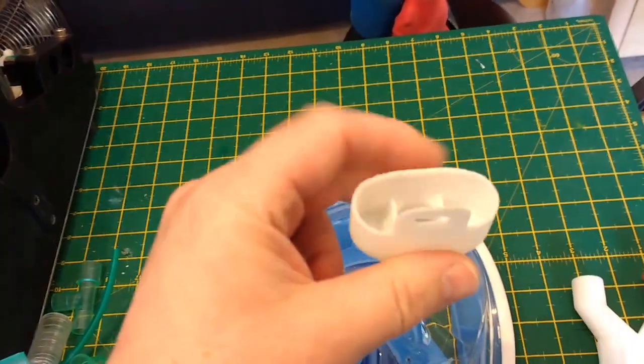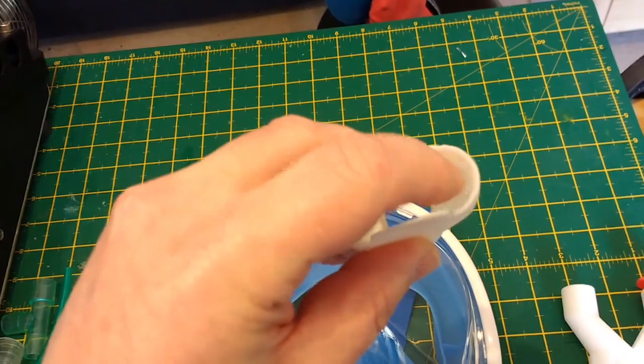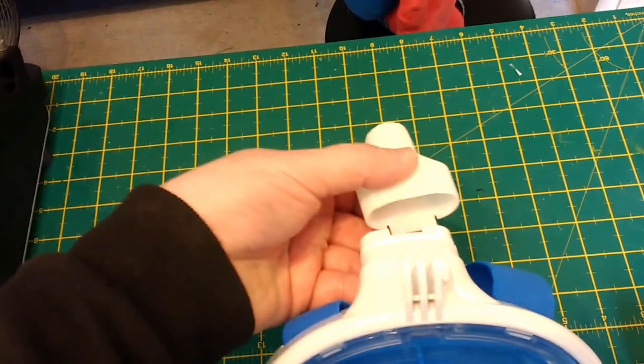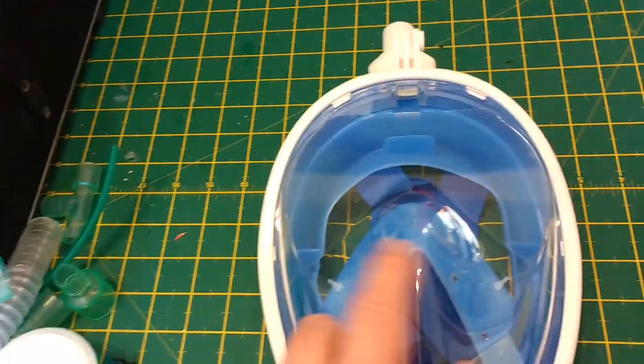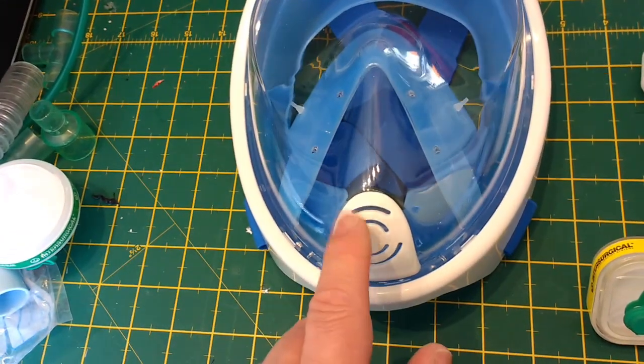Some of the adapters we've seen - such as this one, version seven of one on the web - when fully inserted, block off the two lateral channels. That means you'll breathe in through the center channel and through the two holes, and breathe out entirely through the vent here.